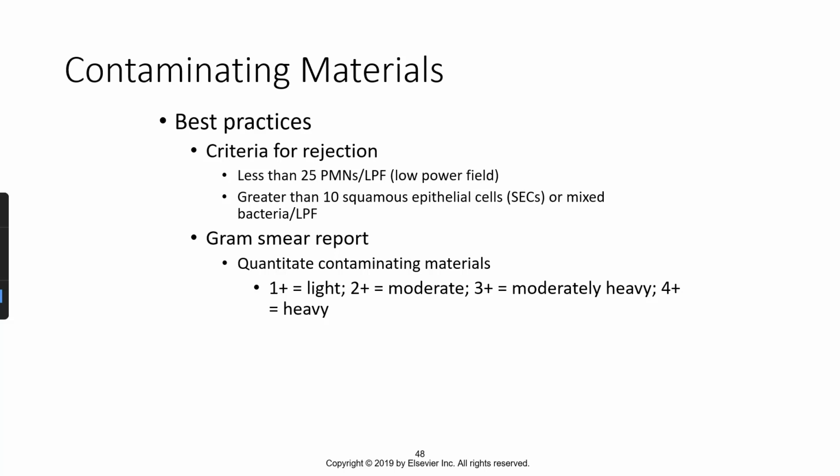So best practices, if you don't see that, reject the specimen and ask for a new one. And unfortunately, that's going to create some tension between the laboratory professionals and the nurses who have to face the patients and actually say, hey, we need to redo this specimen because it's not appropriate. Sometimes the people have left the hospital, they've been discharged, and now the nurse has to call them and tell them that they have to come back and redo it. And patients get really mad because it's a super huge inconvenience. It's not the laboratory personnel's fault.